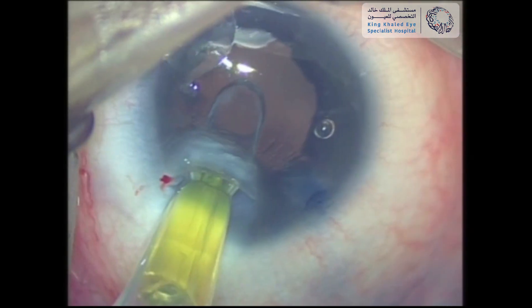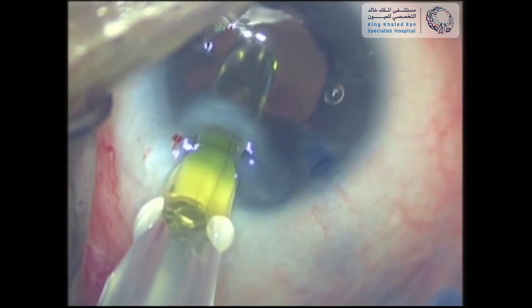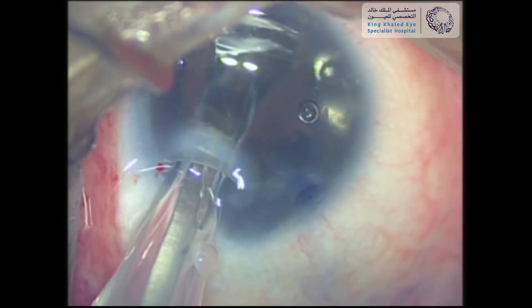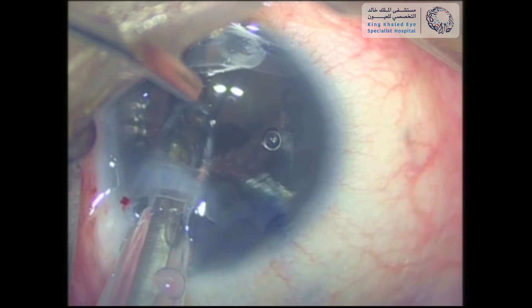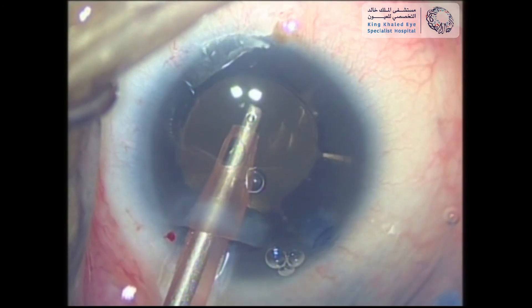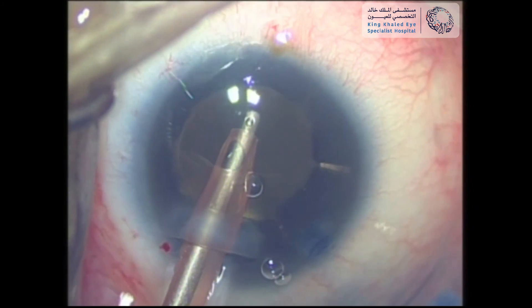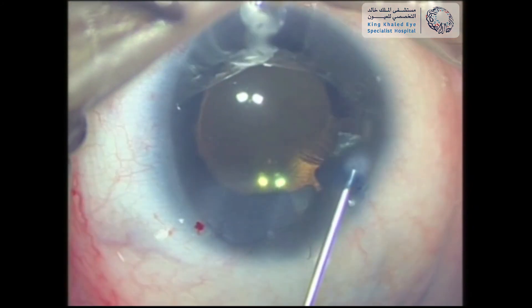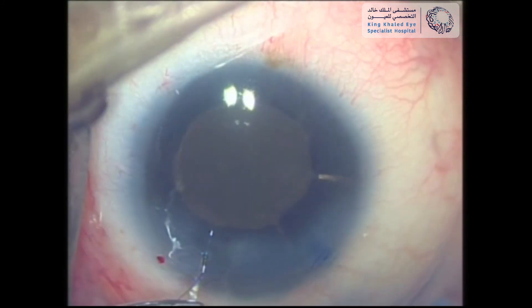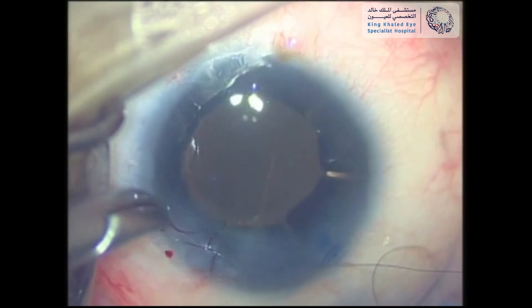Following that, a foldable intraocular lens was inserted into the capsular bag, behind the rings, successfully. At the end, viscoelastic was aspirated, the paracentesis was closed with stromal hydration, and the main wound was secured with a single 10-0 nylon suture.